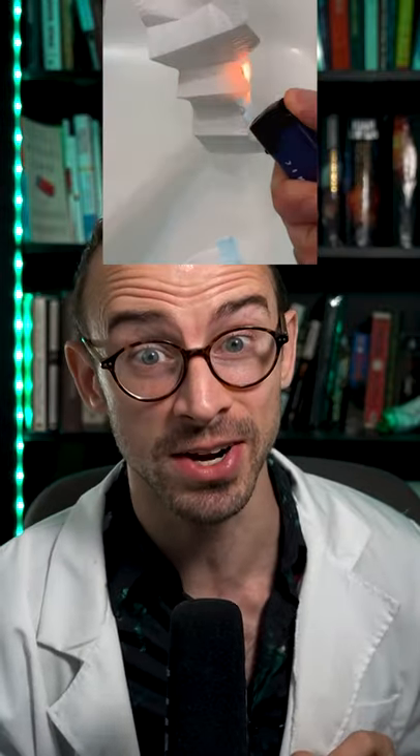But some manufacturers cheat and use paper instead. Here's how to spot them: cut a section from your mask and pull out that inner layer, then carefully light it on fire. It should melt like this. If instead it actually catches fire, you know you've been robbed.